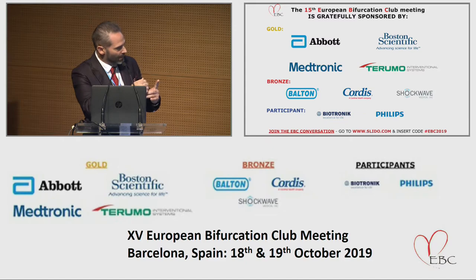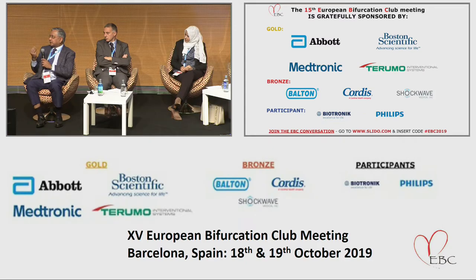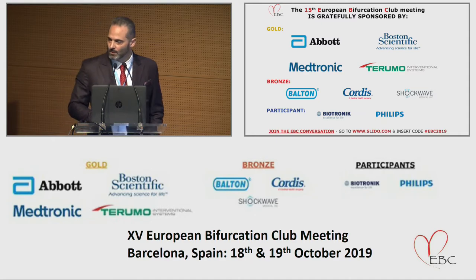Strut protruding into the side branch. The other thing is the ultra thin struts are very difficult to see visually. Usually, you can do it with StentBoost. Usually, I do it with just hypermagnification of the fluoroscopic field. It takes three seconds, and the fluoroscopic dose is completely the same as with other techniques. So you don't increase too much the dose of exposure.